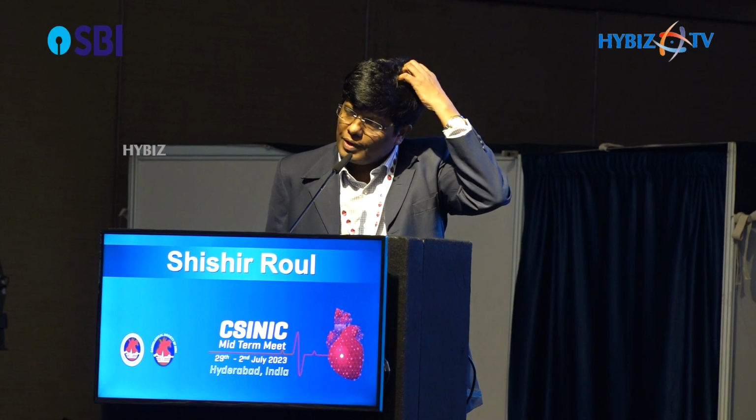So I changed my approach from radial to femoral and went with the femoral approach. At that point of time, I wondered what had happened to my RCA. I was not negotiating. Going ahead, serial balloon dilation with 1.5, I got some result, and it was flowing. In between, I took one more radial access and could notice the second stent hanging in the aorta, with no guide support, no wire, no balloon. I don't know how it is hanging and by which support. So let me see what is happening to my hanging stent and what happened to my RCA.